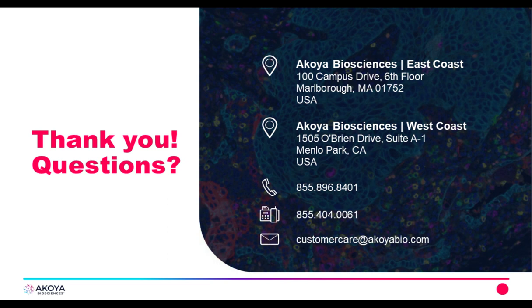Thank you. What is the optimal tissue thickness for CODEX analysis? So I can speak a little bit to this. The tissue has to be between 5 and 10 microns thick, so it needs to be somewhere in that range.